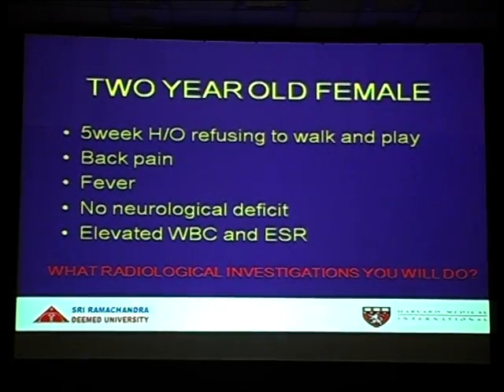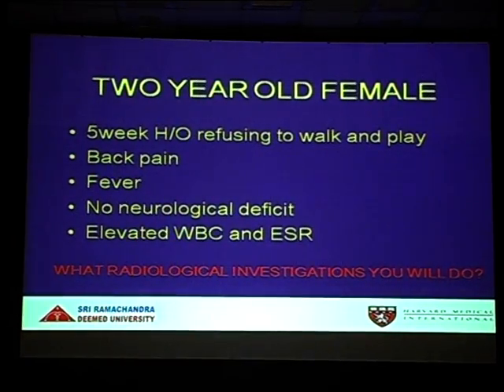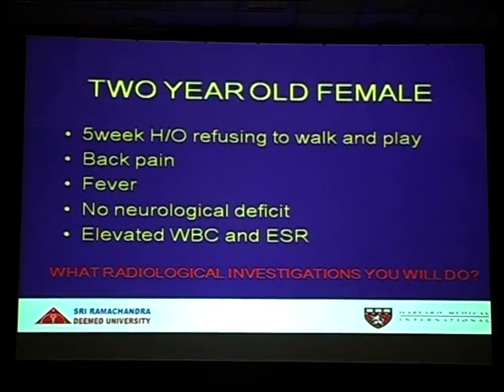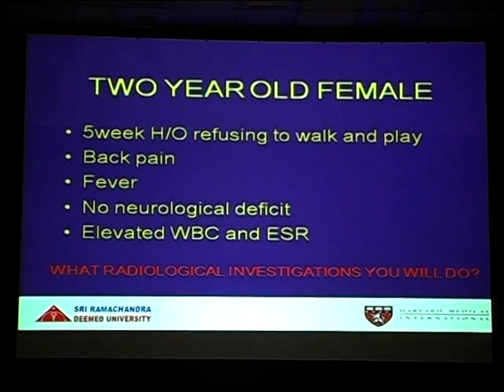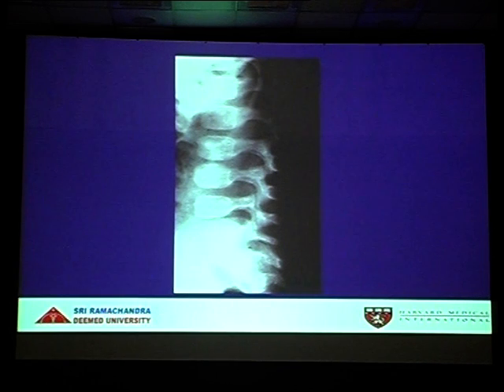Here is a 2-year-old female, 5-week history of refusing to walk and play. That female has got a back pain, fever, no neurological deficit, elevated white cell count and ESR. What radiological investigation will you do for this girl? First, plain X-ray, isn't it? First, you'll do the plain X-ray of the lumbosacral spine, right?